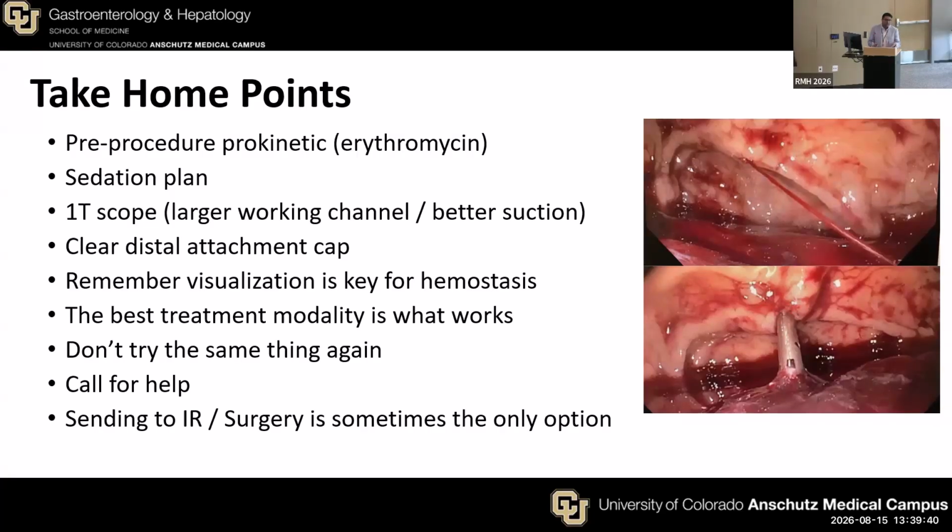The best treatment modality is the one that works, but it's important for you to know the toolbox and know your backup options. Don't try the same thing again. If you can't manage it, ask for help. We're blessed to be in an institution where we always have help around and we can ask each other these questions. And sometimes sending to IR or surgery is the best option. So thank you so much for your attention.